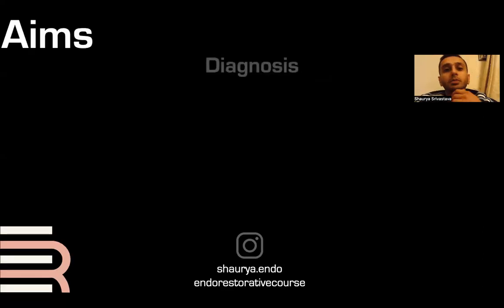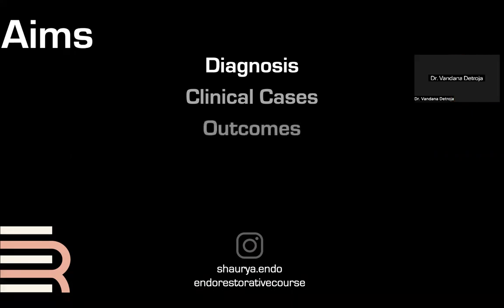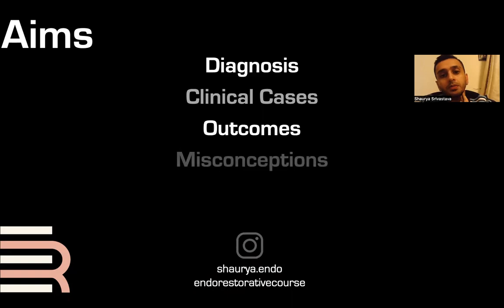All right, so the aims of our presentation today: diagnosis, because CBCT is a diagnostic tool. Diagnosis is the key, because without that, we have absolutely nothing. We're mechanical workers. Then clinical cases, to consolidate why to use CBCTs, the outcomes of these cases where and when applicable, and misconceptions with regards to CBCTs. We'll be talking about that in general terms for radiology as well as CBCTs.